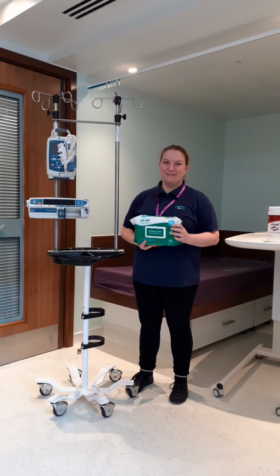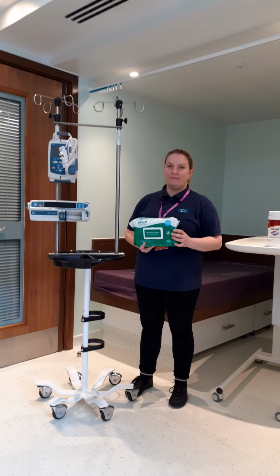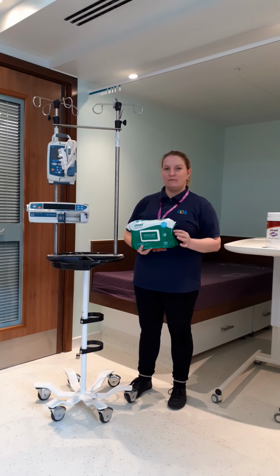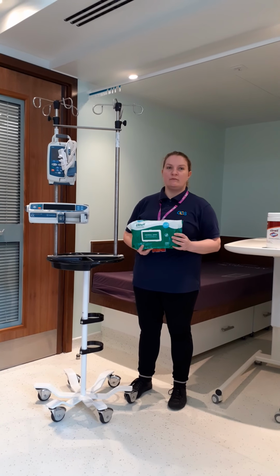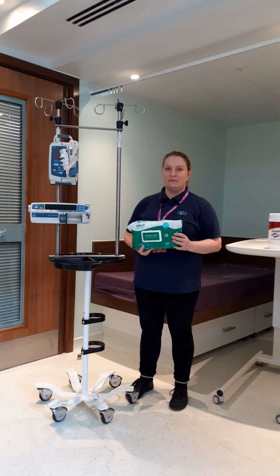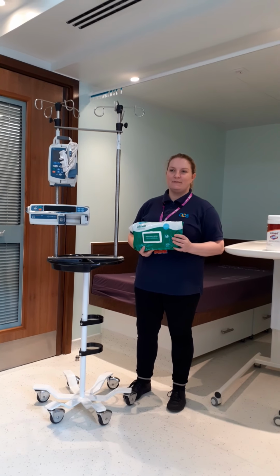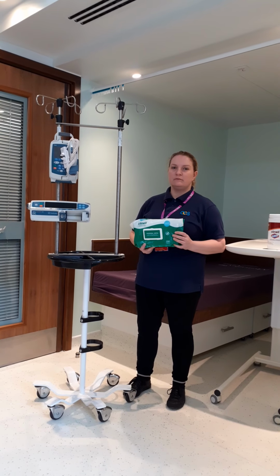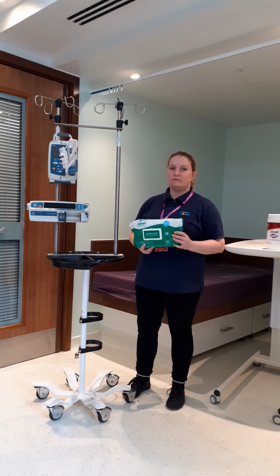In this video, we're going to talk to you about how to clean a drip stand. There are two times you might be asked to clean this. One is part of the daily routine clinical clean that should be happening in any clinical bed space. If you're asked to do it under these circumstances, make sure that you speak to whoever's asked you to in the bed space, and be careful when you're wiping down the pieces of equipment, because obviously they will be connected to a patient and fully functioning.